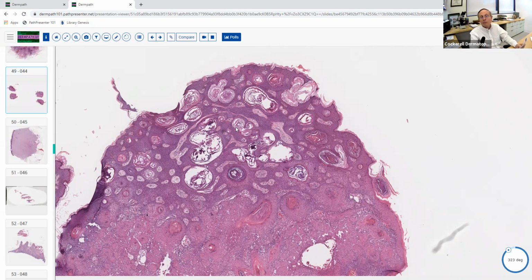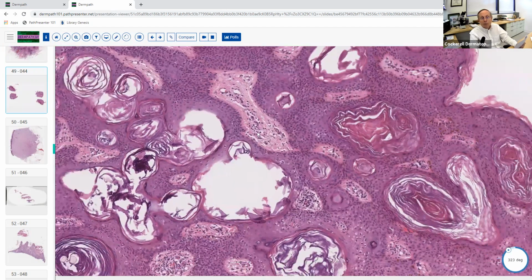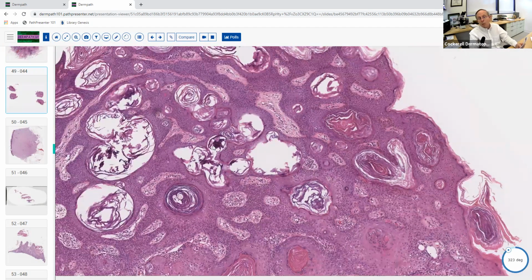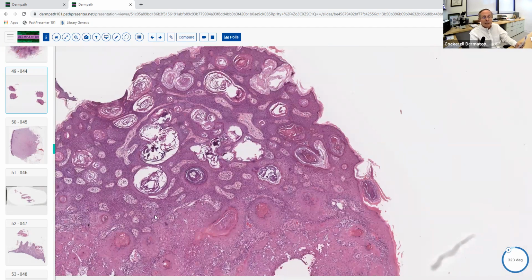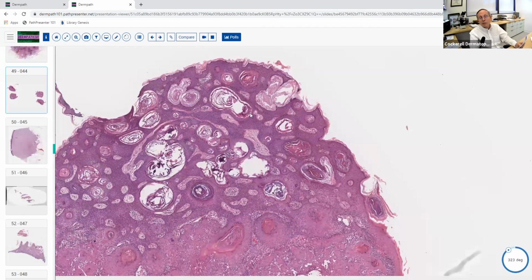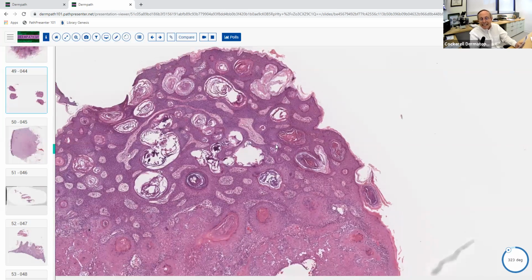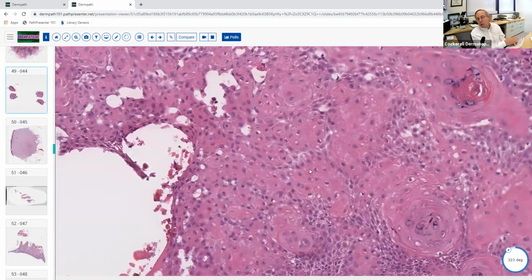Poroma, no, this is not a poroid lesion. These are not eccrine cells here. These are not poroid differentiation. These are horn pseudocysts. It's not a wart, although this area down here looks a little bit like an inverted follicular keratosis slash wart with squamous eddies, but that's not the best answer because you've always got a seborrheic keratosis up here. Squamous eddies mean benign. So whenever you see this, you should move away from squamous cell carcinoma. And notice in this field, even though there's some pseudoepitheliomatous hyperplasia here, there's not a single mitotic figure. There's zero atypia here. So this is not a cancer in this case.